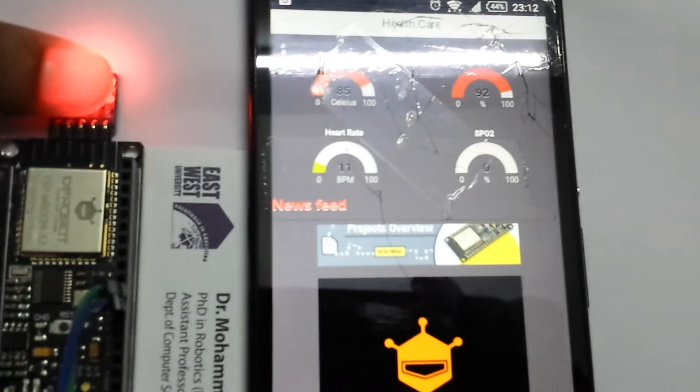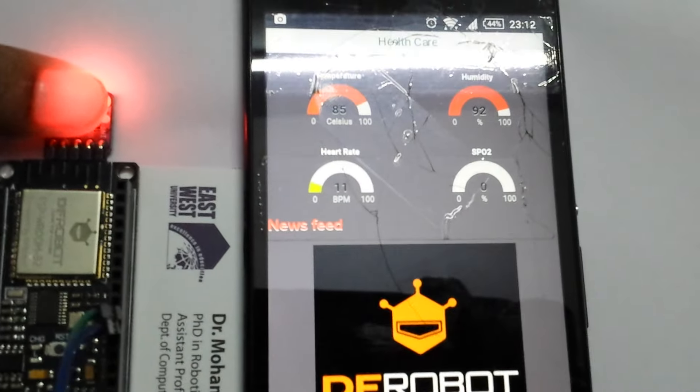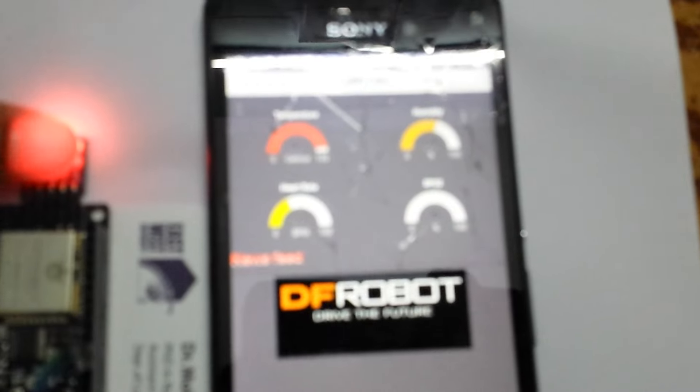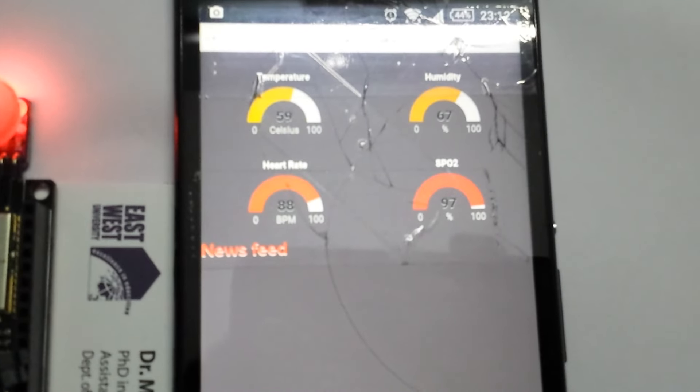If I place my finger on it, you can see the heart rate being measured.